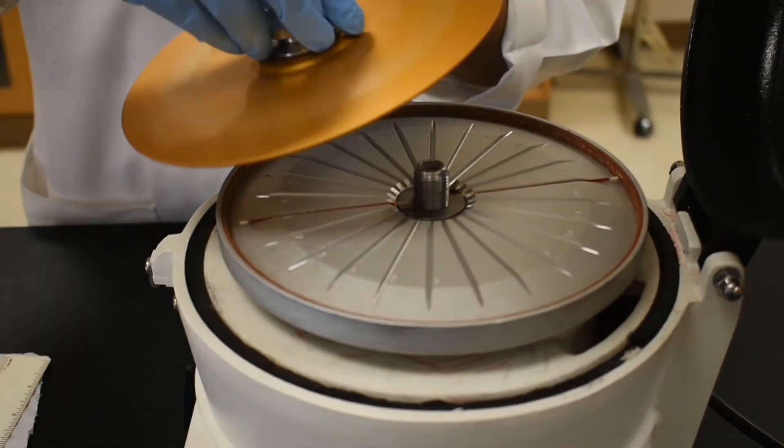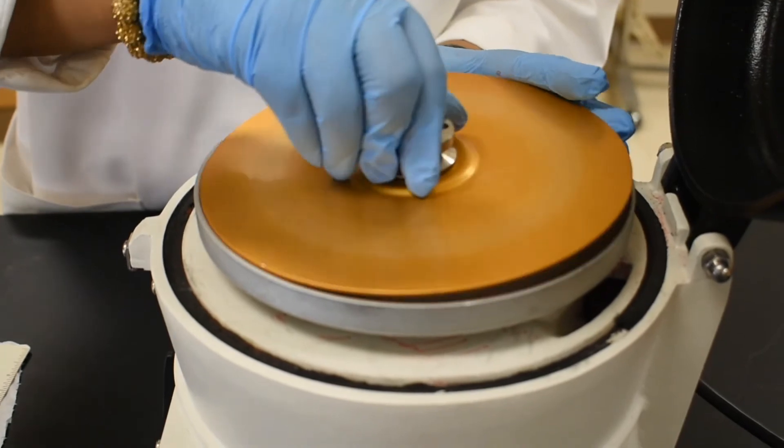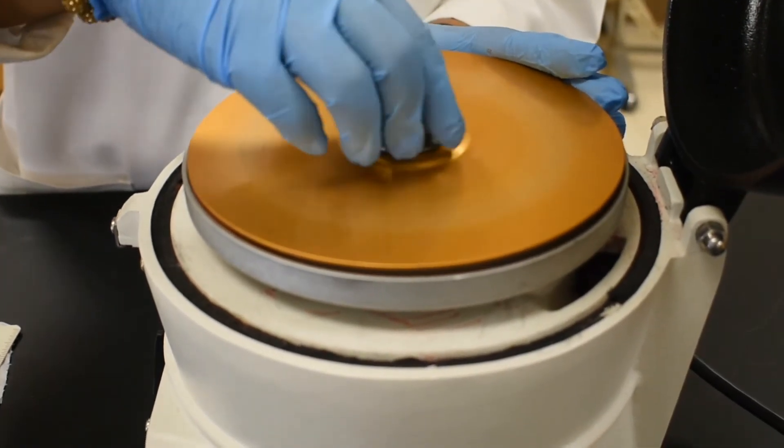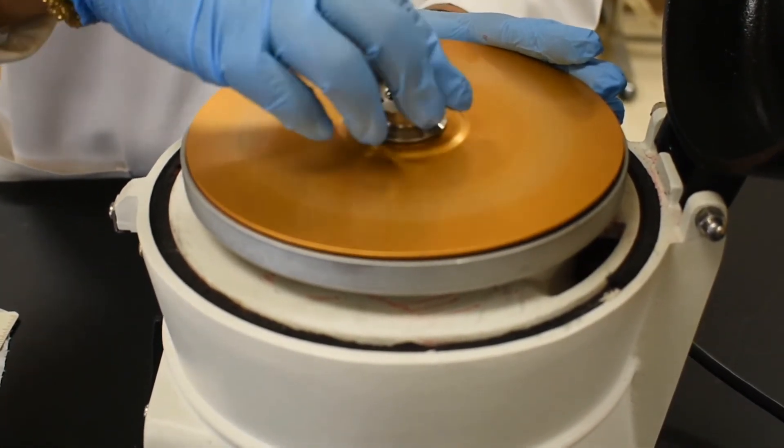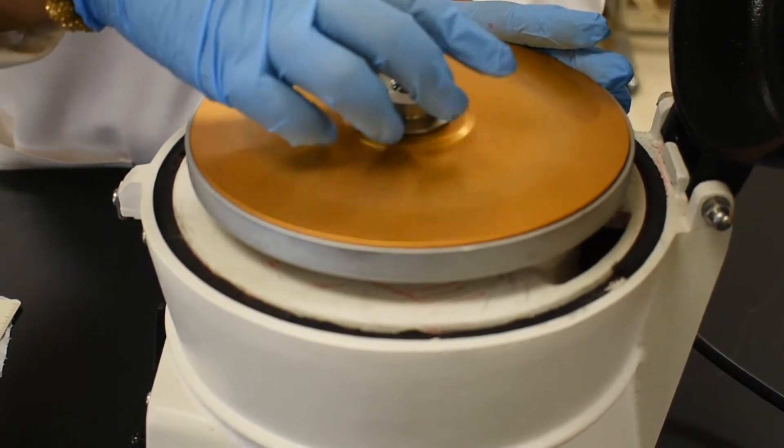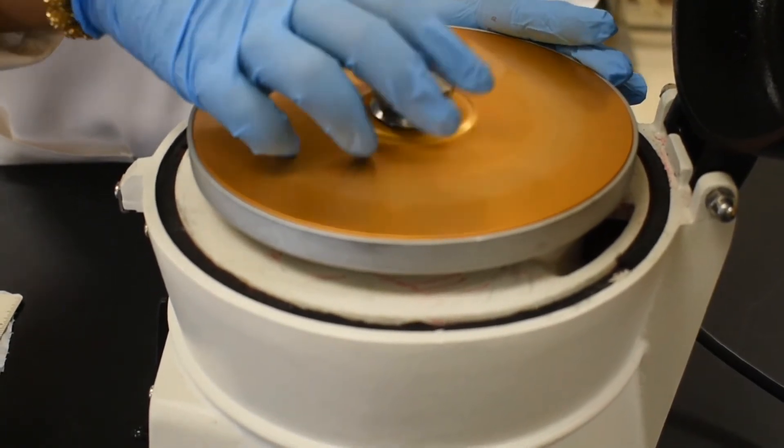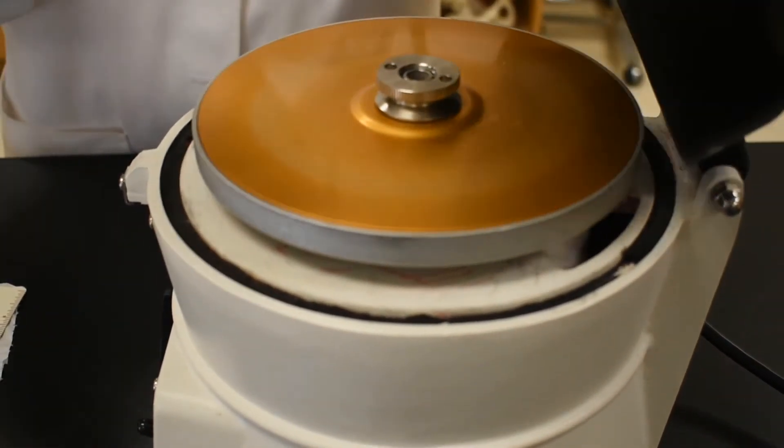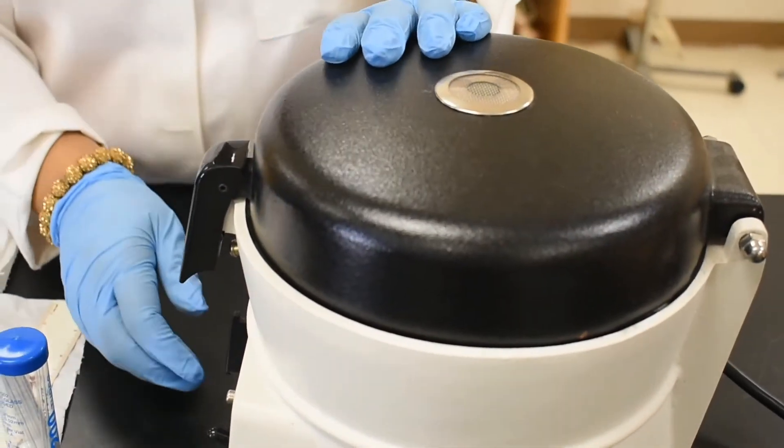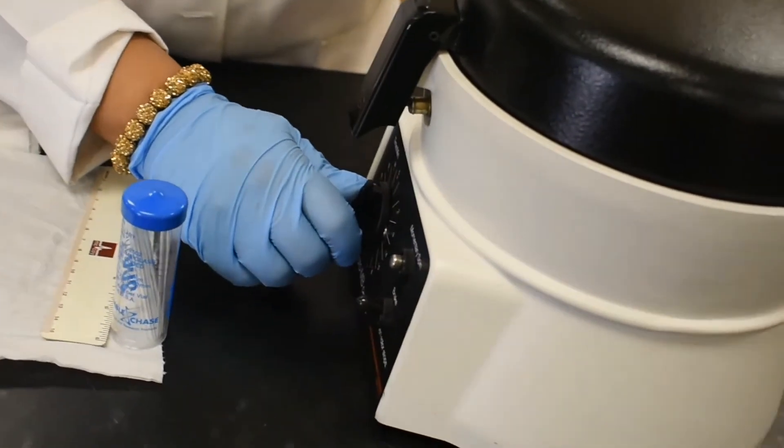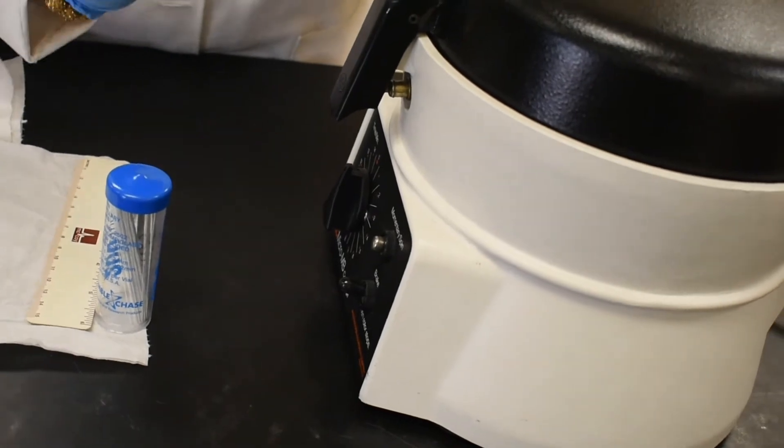We will close that lid. Another important step. If you forget, all you will get are broken pieces of glass once you open the lid. We will close the lid. And now run the centrifuge for five minutes.